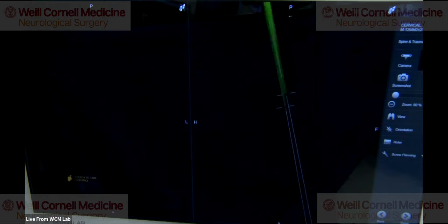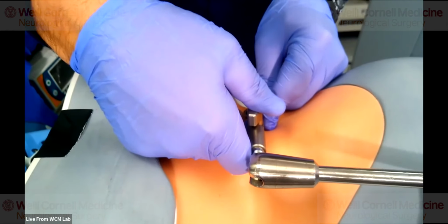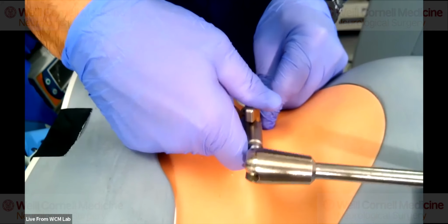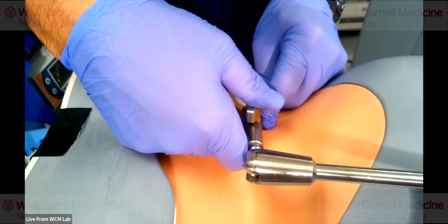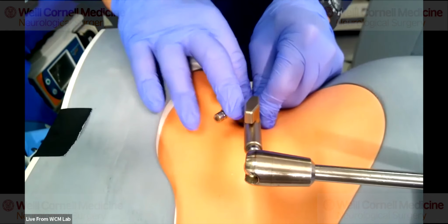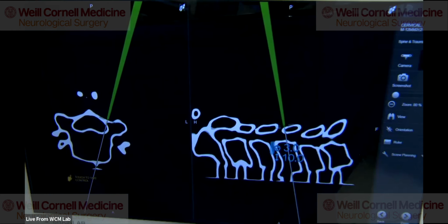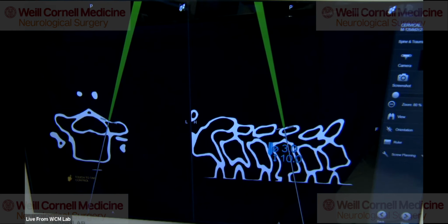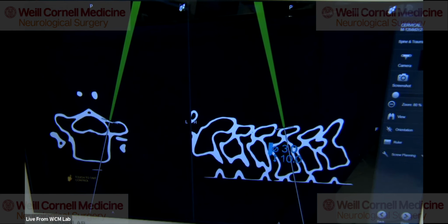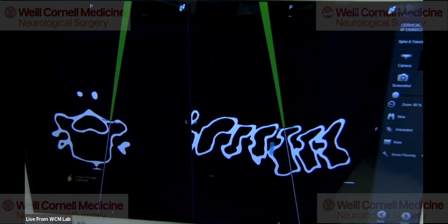So what we're going to do is the assistant's going to loosen the tubular retractor, and I'm going to angle everything south here. Tighten this. So I felt it kind of touching the lamina of C5. So now this looks better, right? So now the inferior edge is really over the lamina of C5, or the facet of C5 and C4.